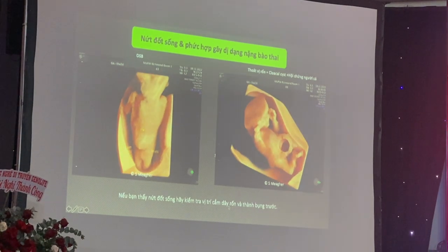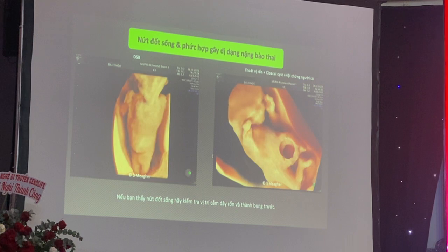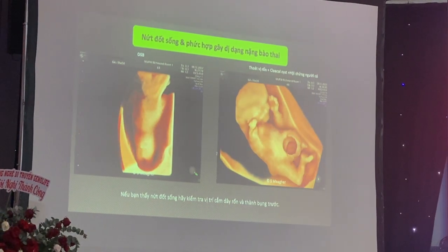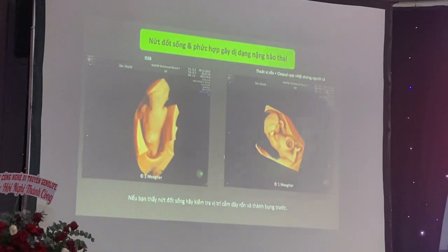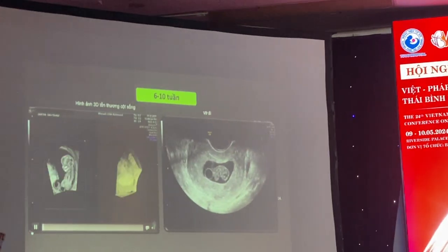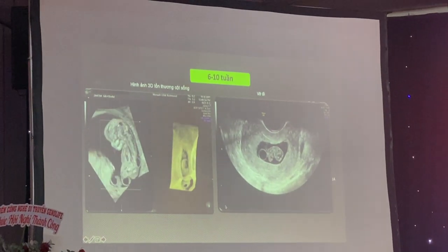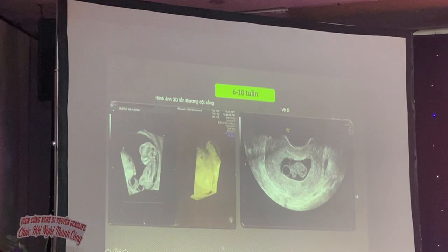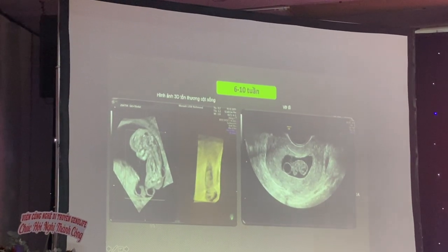So it's quite prevalent in the first trimester. And the second thing is make sure you turn up your gain, because that's how you see the amniotic bands. If your gain is not high enough, you will miss them. In terms of looking at the spine, we are picking these up earlier in the pregnancy. So this is at 10 weeks, prior to drawing some blood for cell-free DNA. And you can see you have a defect in the lumbosacral spine.